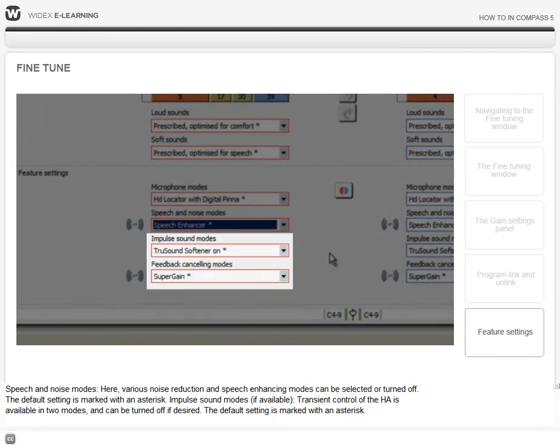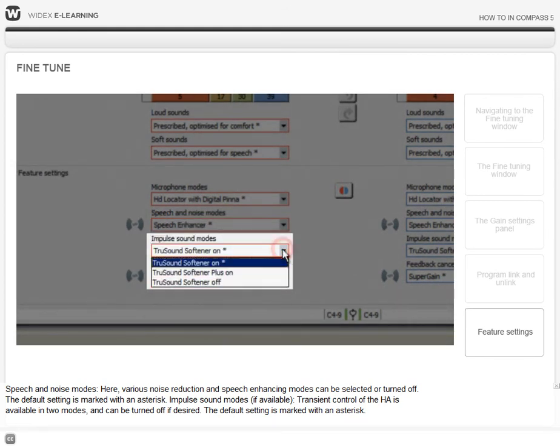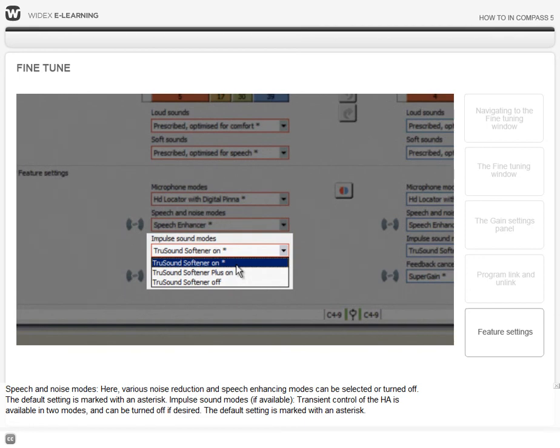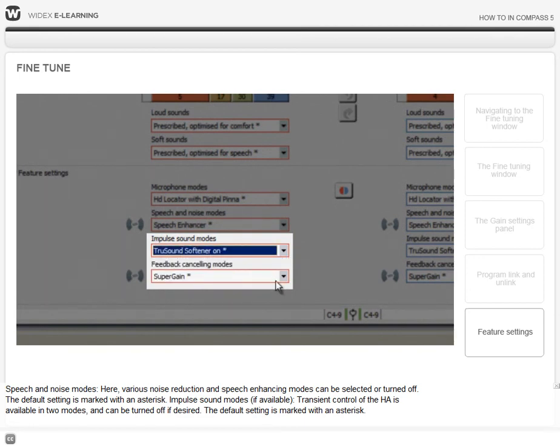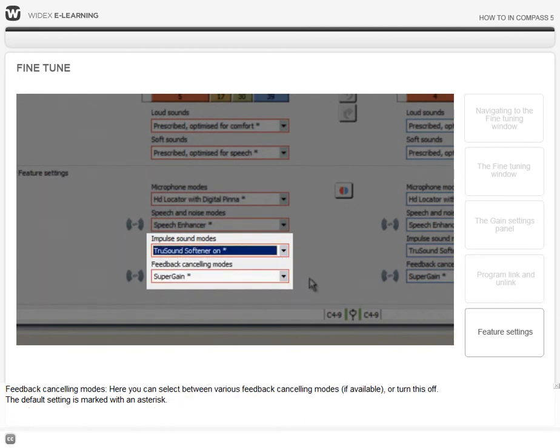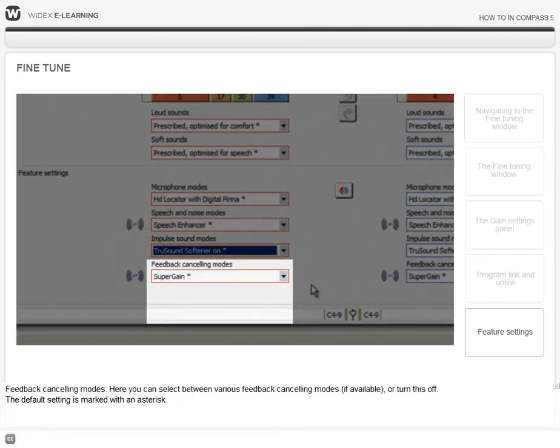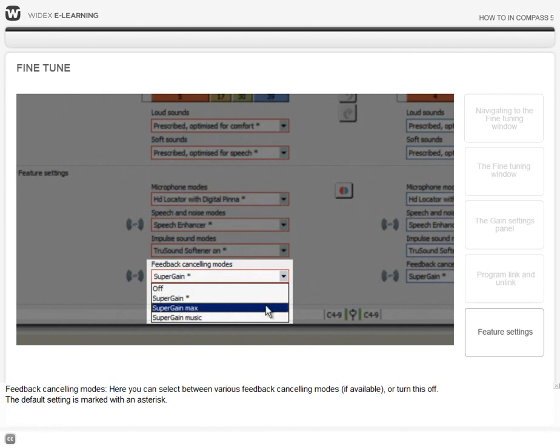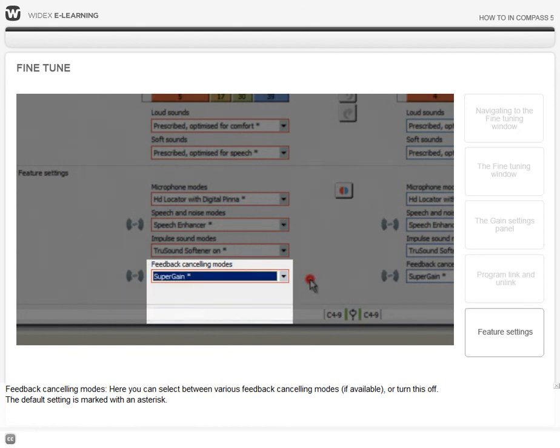Impulse sound modes, if available: transient control of the hearing aid is available in two modes, and can be turned off if desired. The default setting is marked with an asterisk. Feedback cancelling modes: here you can select between various feedback cancelling modes, if available, or turn this off. The default setting is marked with an asterisk.